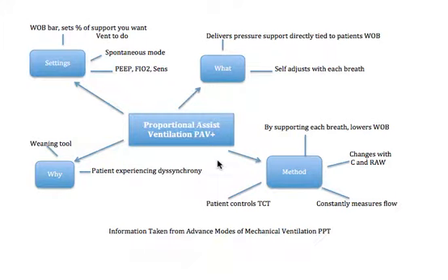All right, guys, we're going to go over proportional assist ventilation, or the PAV+. So the information, again, was taken from the advanced modes of mechanical ventilation. So when we talk about the PAV+, let's look at what that is, okay? So let's look up here.